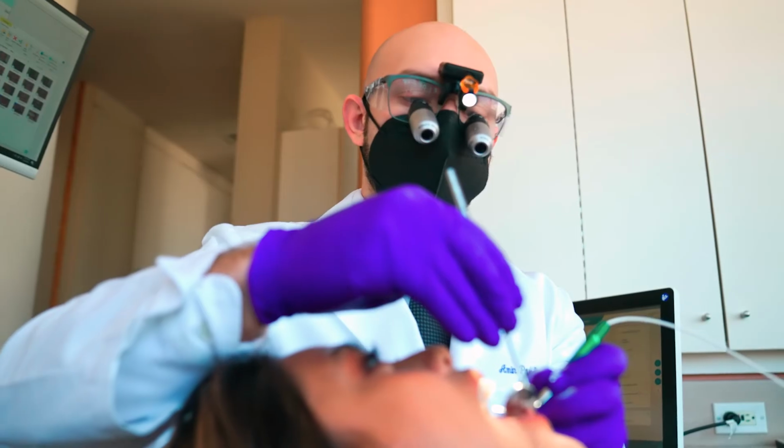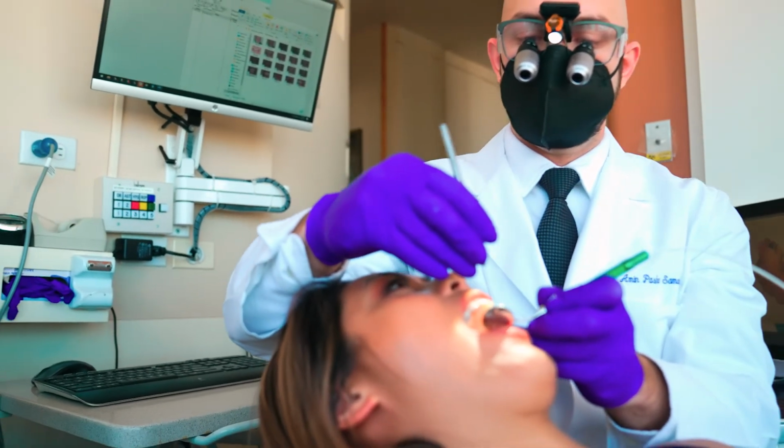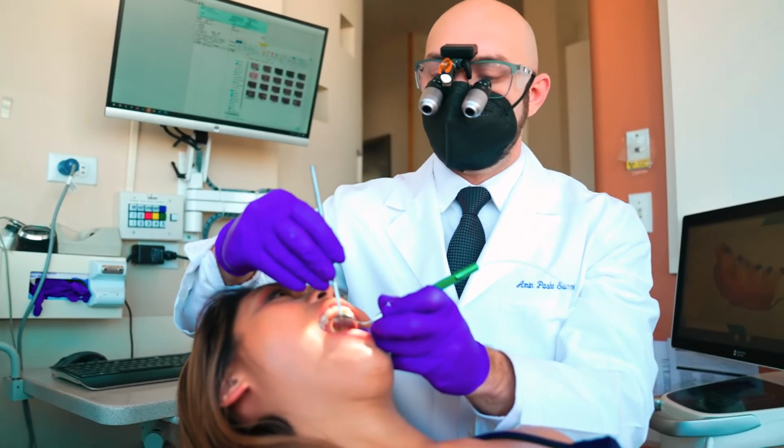Once it disinfects the gum tissue, then we switch the frequency of the laser, and now the laser will target the hemoglobin in the blood that creates this sticky membrane for the stem cells to come and create new bone and gum tissue in that sterile environment that we created, and that's how we get the bone regeneration.